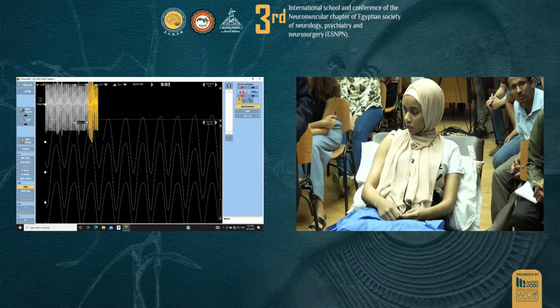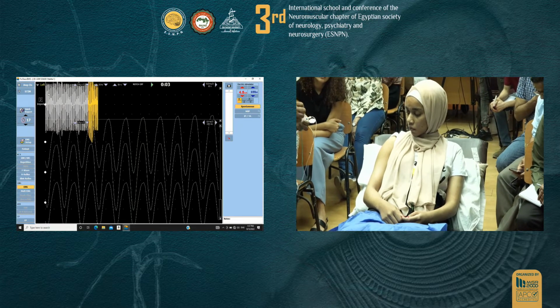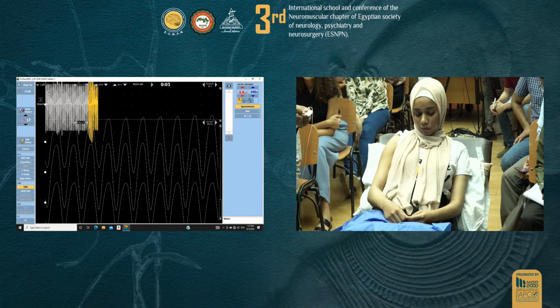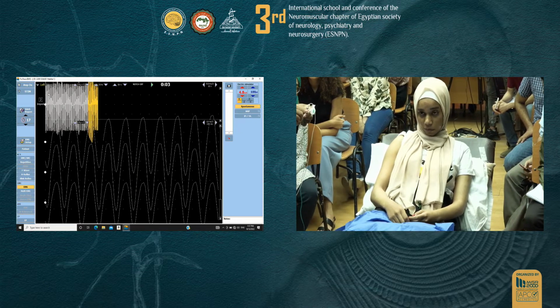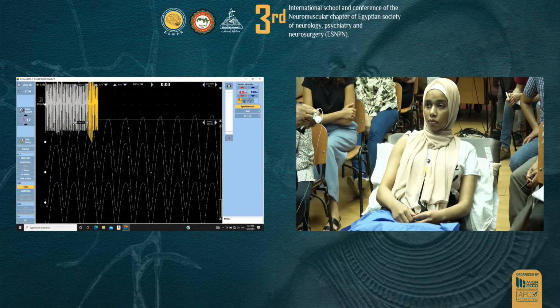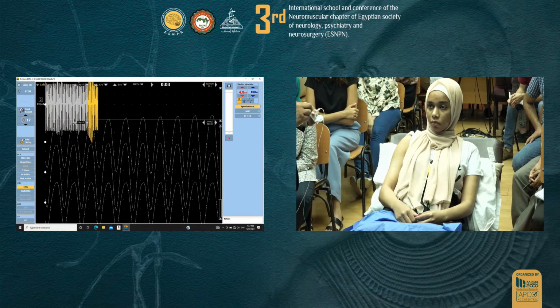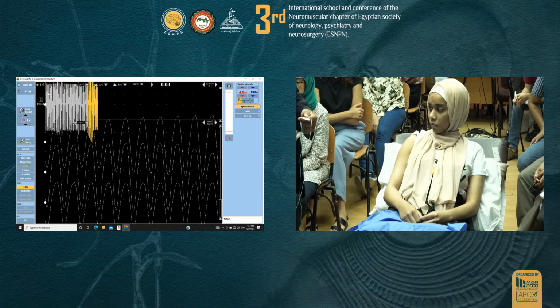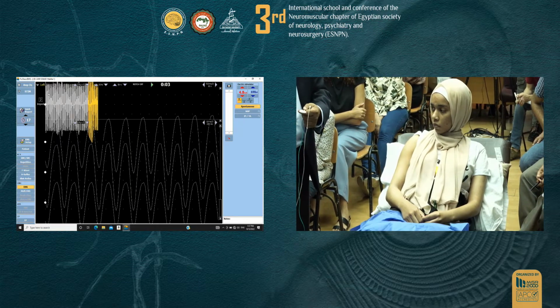So you put a ground. Typically we're doing this with the patient lying, so you don't move the ground every time. You put it at a place and then it's good for the whole limb. I usually use a place where I know that it'll be out of the way and I'm not going to go to that site. So usually at the back of the hand.